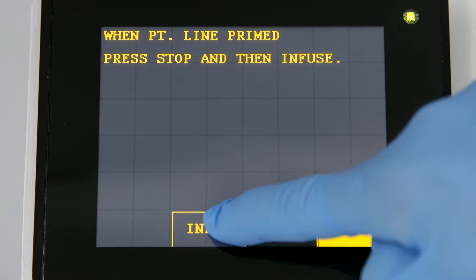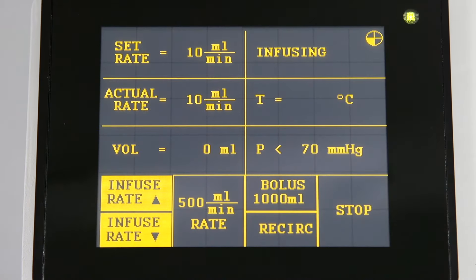Once the system is connected to the patient, press infuse to begin operation. Infusion will automatically start at 10 milliliters per minute. Infusion rate, set rate, total volume infused, temperature of the fluid, and line pressure are continuously displayed.